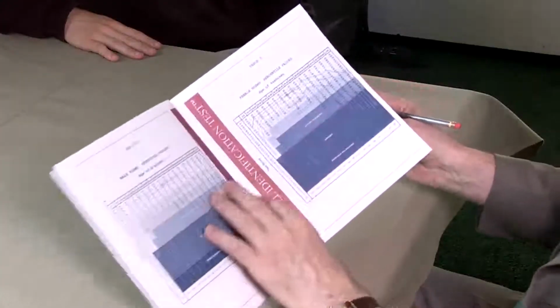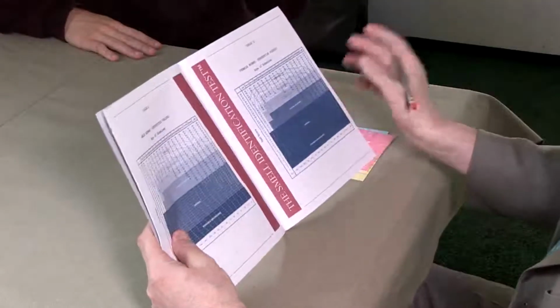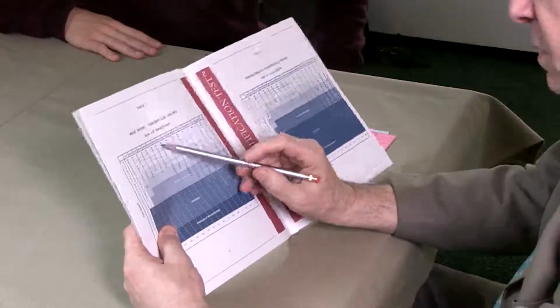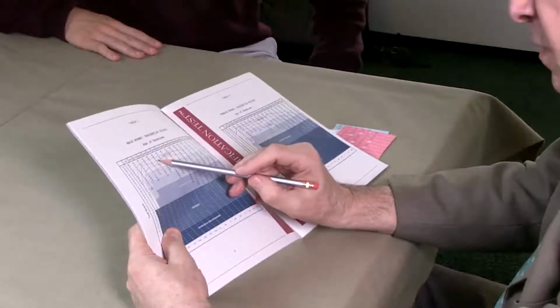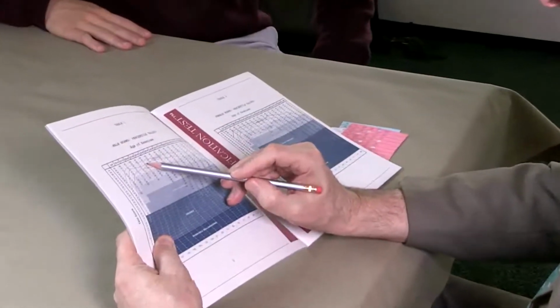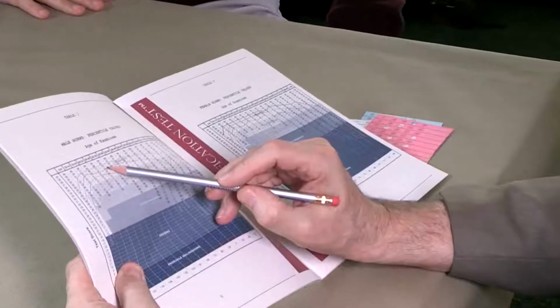And we can look that up on the normative data sheet located in the administration manual. And you'll see that there are norms from page 8 to 9. So we can look up a person, in this case he was 32 years of age, scored 37, so he's actually at the 53rd percentile. Now he's right on average for a person his age.